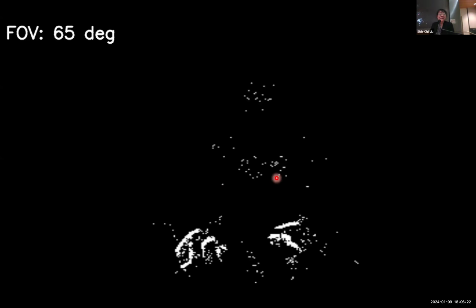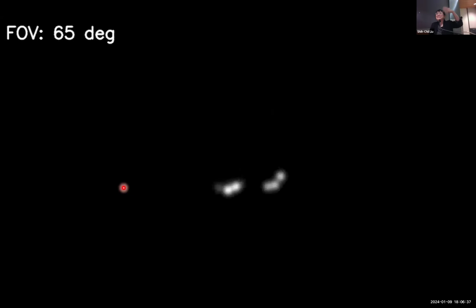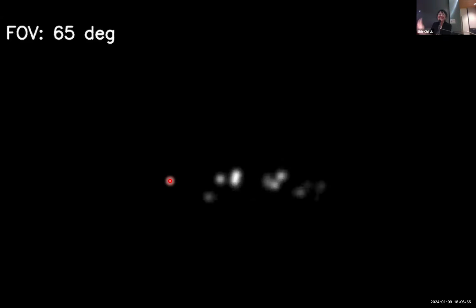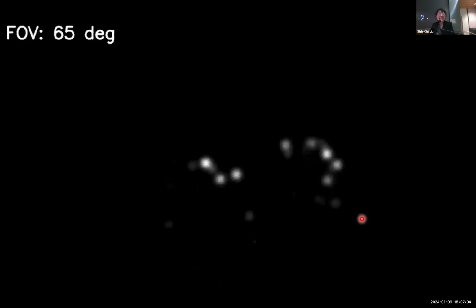And so just for fun, here I'm going to show the phosphene output, and I'm going to ask you what you think you see. Imagine that this is what you would see. You have electrodes, and I'm trying to present something to you. Can anybody guess what that could be? Somebody dancing. No. Snow in Switzerland. Snow is good. Yeah, very good. If you look at it long enough, you could kind of guess.